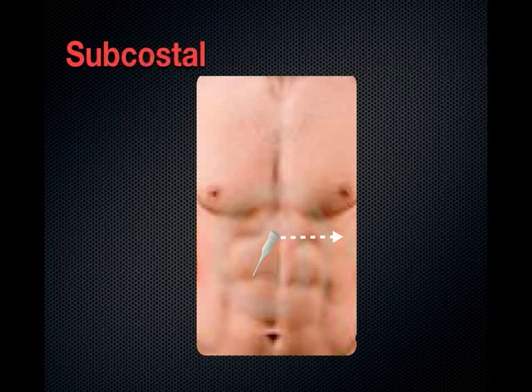Approaching the patient from below the diaphragm to look at the heart has several advantages. Some patients are not able to obtain a transthoracic view because of hyperinflated lungs or being on a mechanical ventilator. Many times the subcostal view is the only view you can get. It's also the best view to assess for volume status of the inferior vena cava.